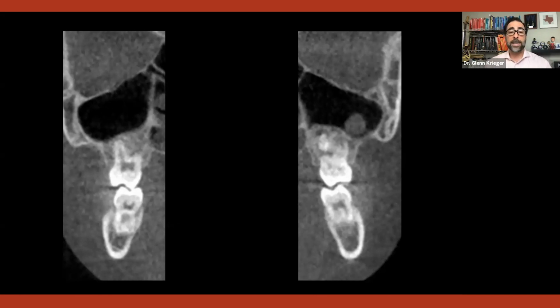And the best part is when I expand him and I widen the palate, what's on the second floor above the palate? The nasal floor. So when I widen his palate, I widen his nasal floor. And in doing so, I open up the room. And if you know your laws of physics and the flow of any sort of airway or liquid, you know how turbulence plays a role relative to room created, if you will. And it's not equal. For every millimeter, you get 4 times or to the 4th power amount.